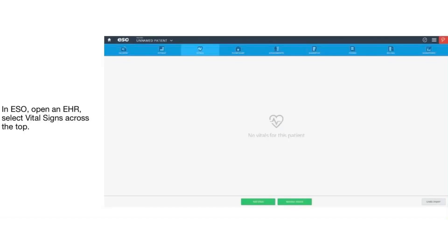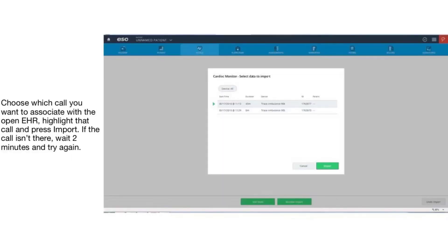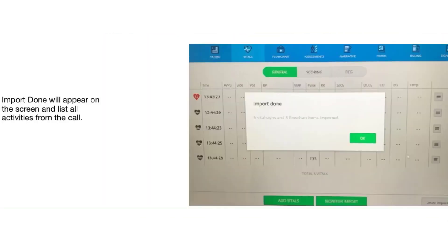When using ESO as your ePCR platform, open a new EHR report and select vital signs across the top. Select the green tab labeled monitor import and then select Zoll Cloud. ESO is configured to query your Zoll Case Review account every two minutes. When it sees a new case file available, it will display it here and allow you to associate the call that you would like with the EHR report that you're working on. Select the call and press import. The import done message will appear on the screen and you can select OK.